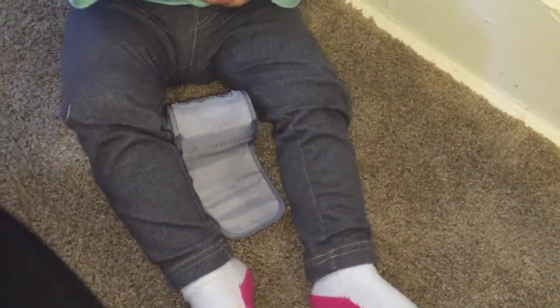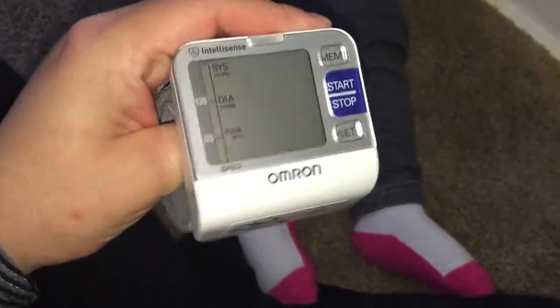I'm shutting off the RelyOn and putting the camera down again for just a second so I can put the Omron on accurately. You don't put it on tight, just snug enough to hold on your arm, and then you hit start.